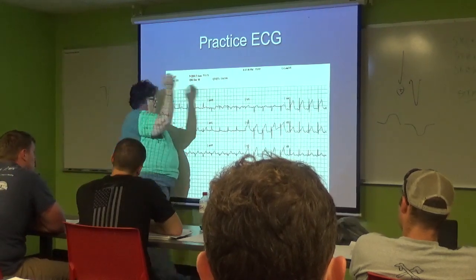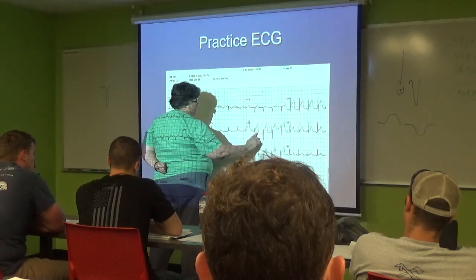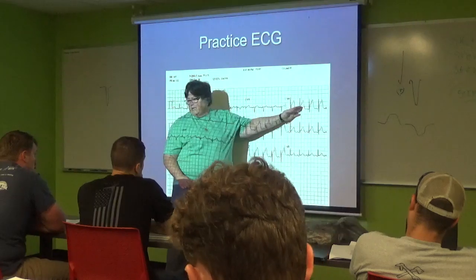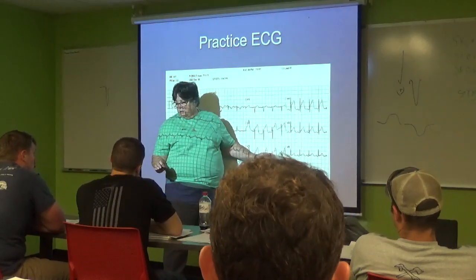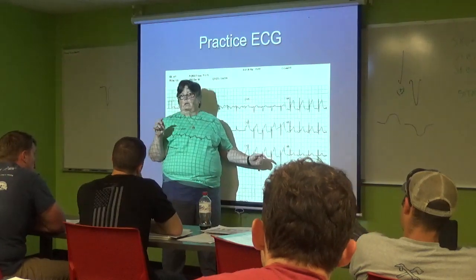And let's just fix our septal. Do I have anything here? No. Do I have anything here? Yes. So this is really the cool thing. What's this MI called? Anterior MI with septal and lateral involvement.